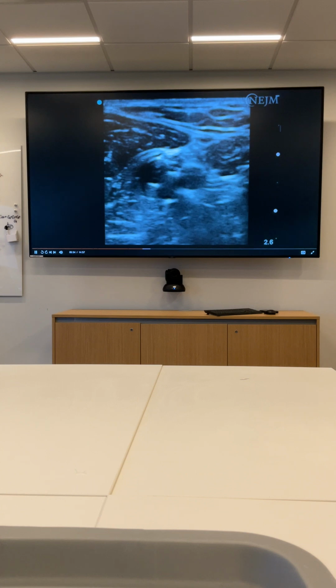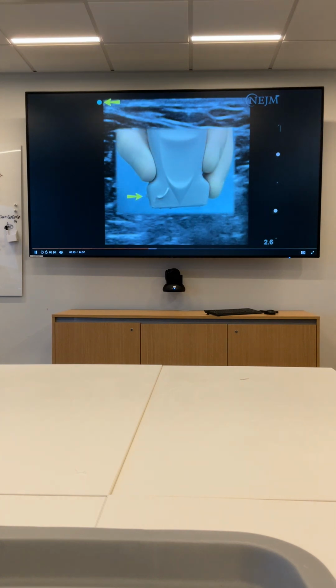bottom of the image. There are centimeter marks on the sides of all ultrasound monitors, so it is always easy to determine the depth. Depth should be adjusted so that the target vessel is in the center of the image. Left-right orientation should also be easy because the symbol on the left side of the ultrasound image correlates with the indicator mark on the transducer.